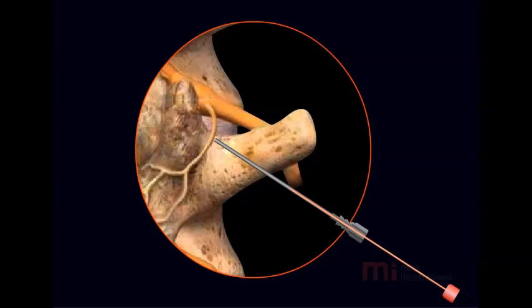A Radio Frequency Electrode is inserted through the needle, and a small electric current is passed to test the position of the needle. Finally, the electrode is heated to stun the nerve, thereby preventing it from transmitting painful signals to the brain.